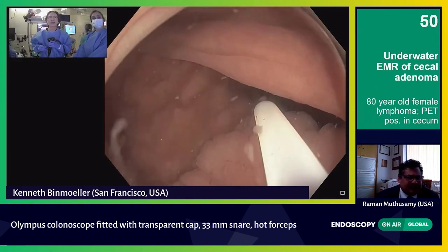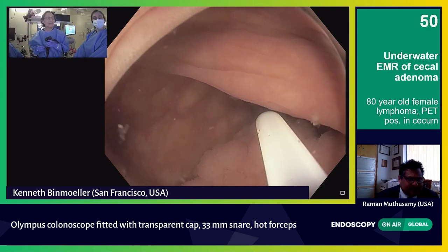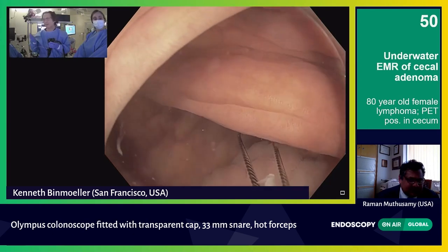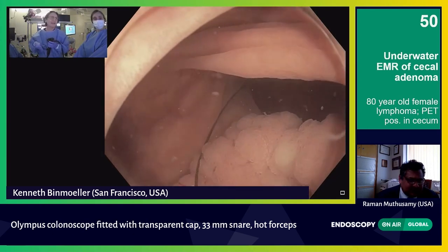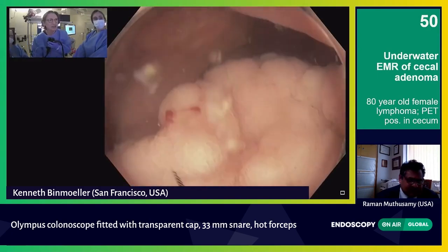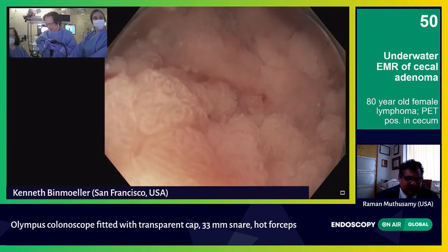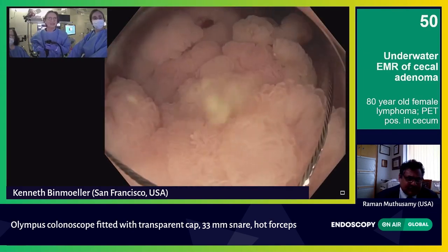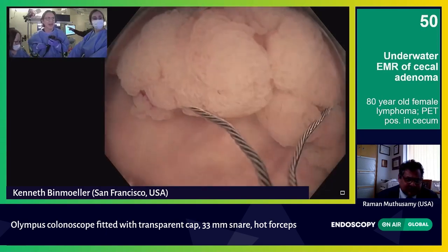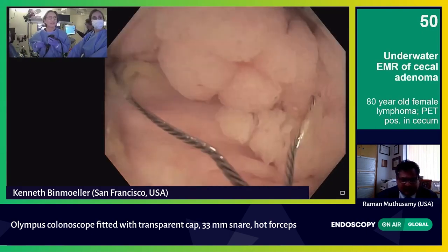Let's open up the snare. I'd like to get a sense — with the floating effect, maybe I can capture this en bloc. That's always my goal — en bloc with the contraction. Open, Genie. I have Genie next to me on my right and Kristen to my left. What I'm doing now is with the snare, I'm going to try to scoop that overhanging part and draw it over to the other side. Just spend a little time wiggling. 33 is the largest snare that I have, and I'm just jiggling, trying to get the whole thing in.